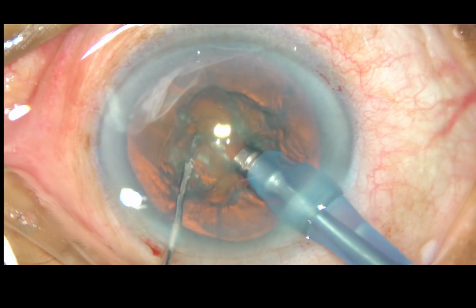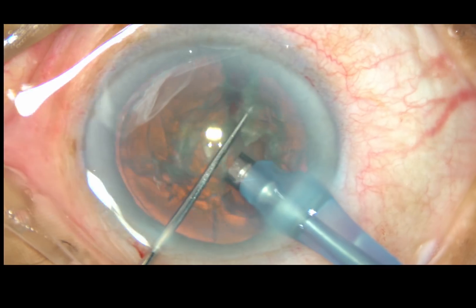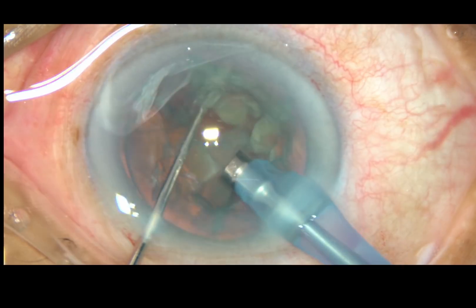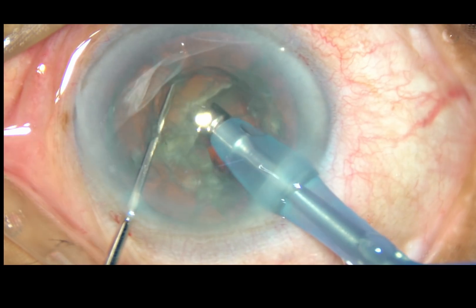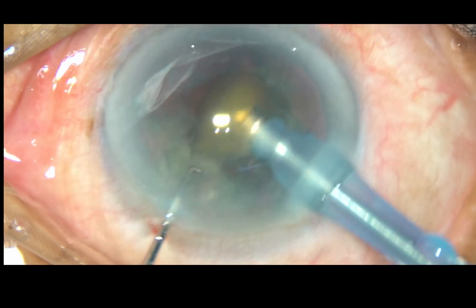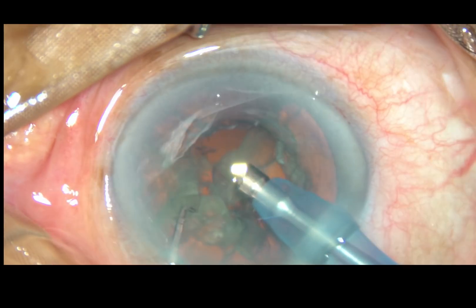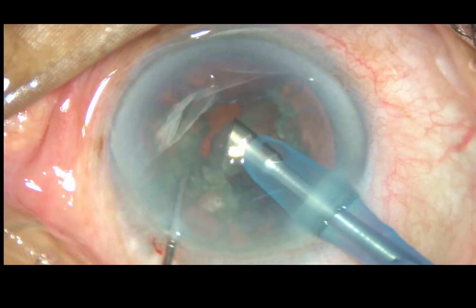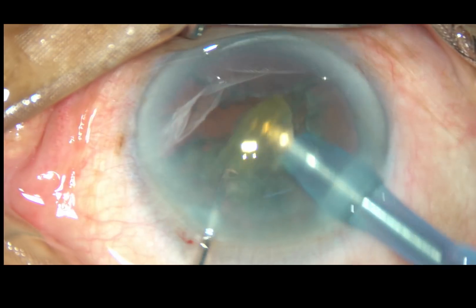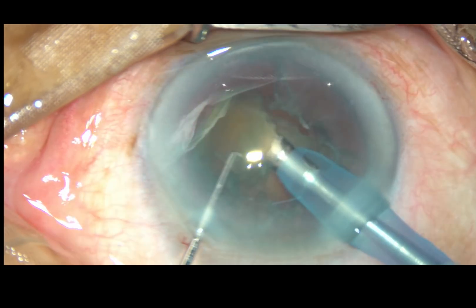As I tried to hold this, I found that I cannot hold it with high vacuum. So I applied little vacuum and I could hold it. Fortunately, the nucleus is brittle and it divided into pieces easily. Now each nuclear fragment is being emulsified with ultrasonic energy and removed.